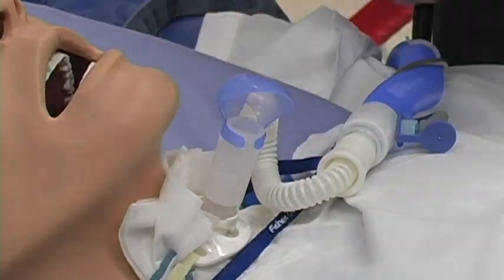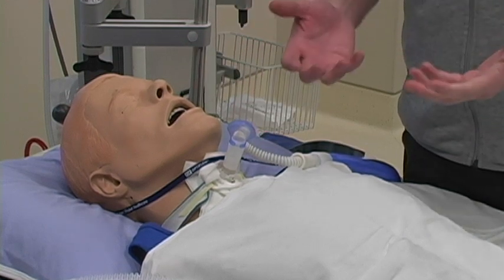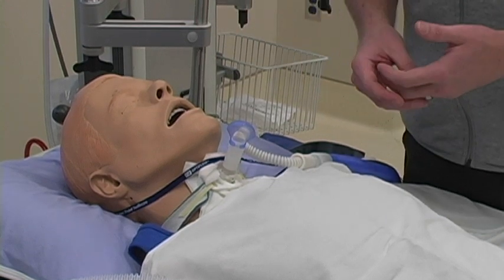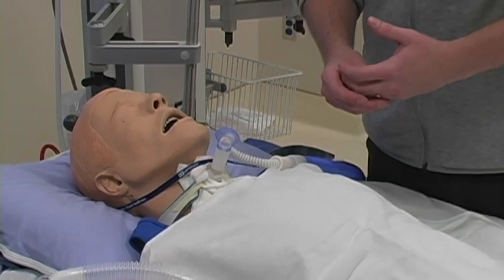Yeah, so it's kind of an ideal thing for our trach patients because we're bypassing their upper airway, which would normally heat and humidify their inspired gas. So because we've taken that away, this is a great thing for them. They just tend to love it, and it really does work well with their secretions as well.